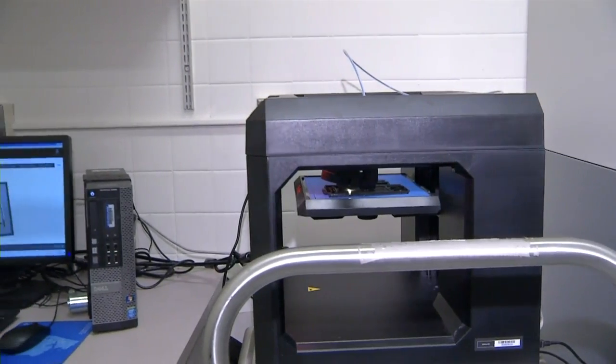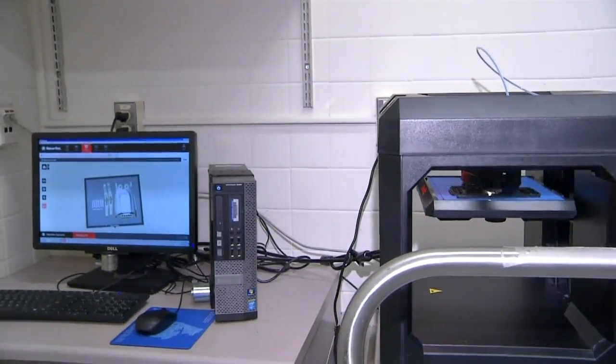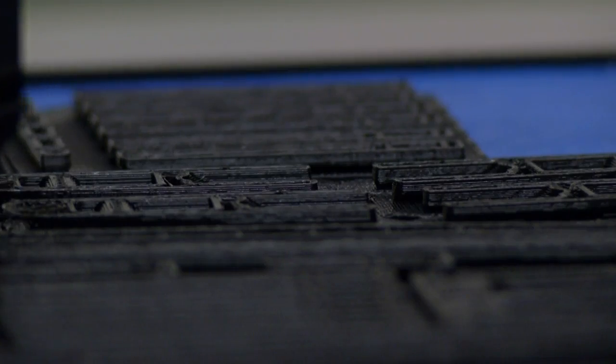I came across an article about 3D printing and it was such neat technology. I started reading more about it and then I came across a YouTube video where some individuals had actually 3D printed a prosthetic hand for a little boy. He went from being the different kid in class to being the special kid in class, because there's a big push to make these things more aesthetically pleasing — people are putting Wolverine claws on them or making them look like an Iron Man hand, as opposed to the traditional big bulky prosthesis.